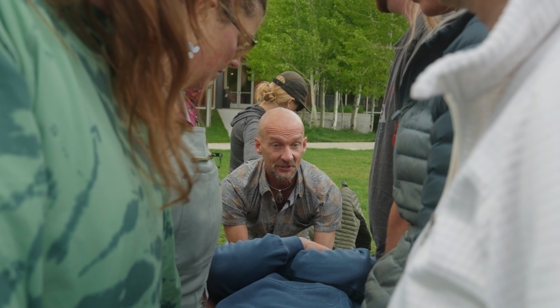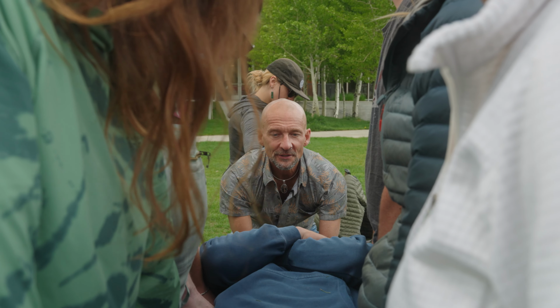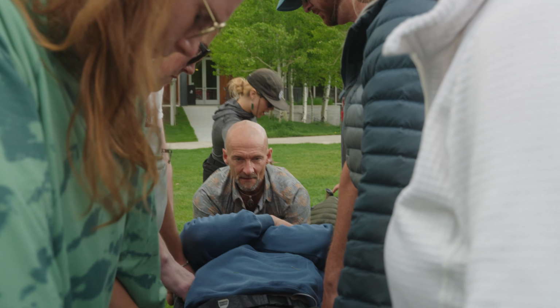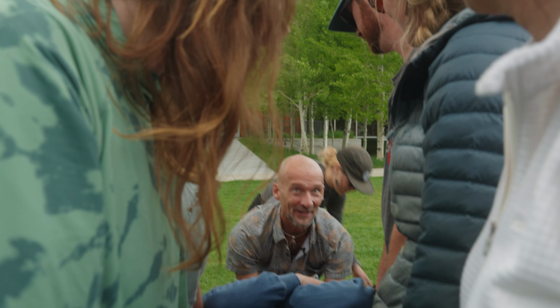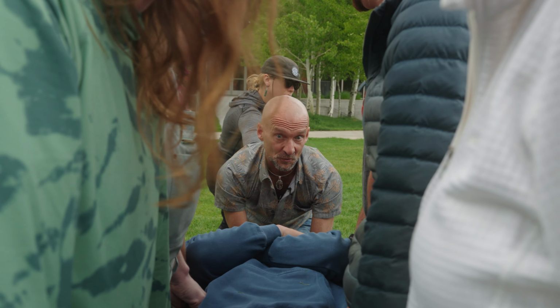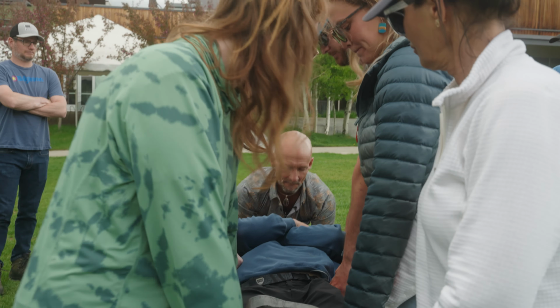Anyone not ready? You're gonna shuffle, don't cross your feet. It'll take a minute to get the pacing. 1, 2, 3, shuffle. Excellent, excellent. Stop. Oh, hence we've got a spotter for a reason, okay? Okay, excellent. Now let's actually go towards the feet. Okay, moving, moving, moving. Excellent.